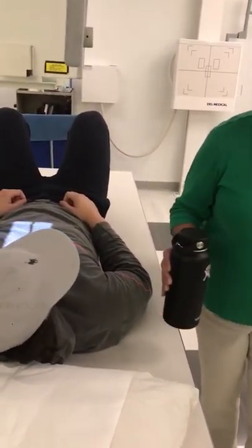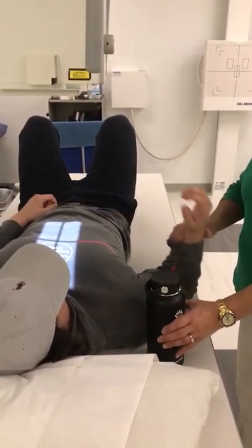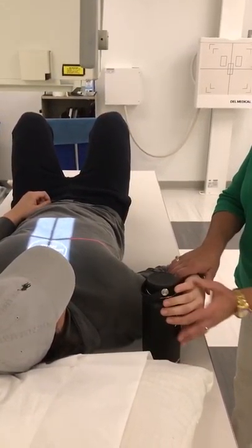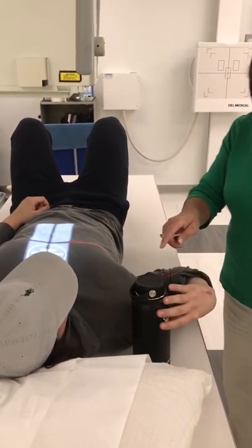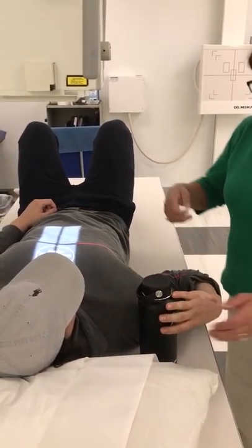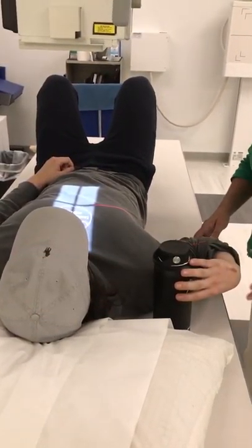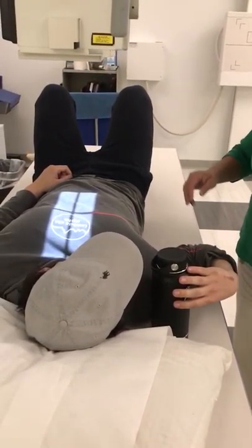Now, I'm going to move the corner of the pillow up to make room for this cup of barium. And sir, I want you to just hold that cup of barium. And there's a straw in there. Don't you see that? The straw? Yeah, okay. Just keep your head straight. There you go. Just turn your head to the side. There you go. All right.